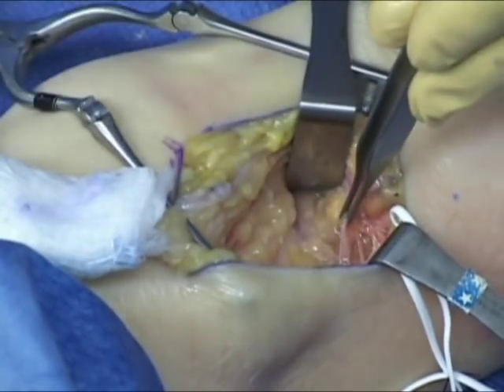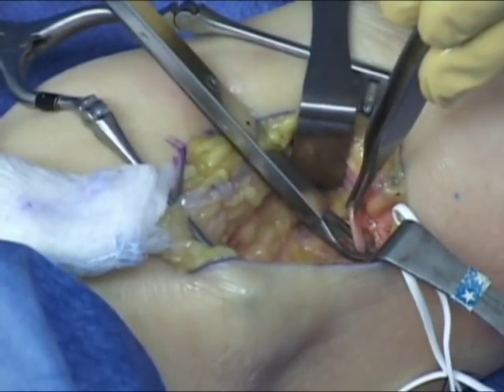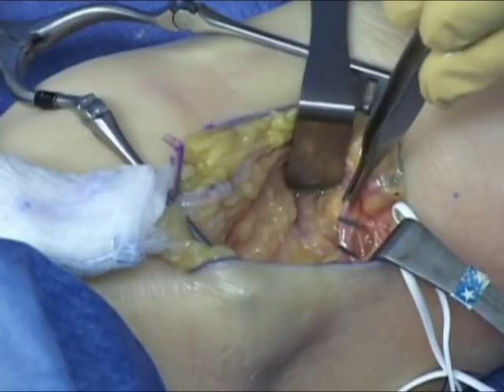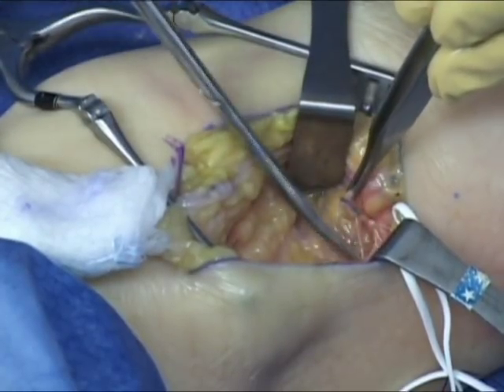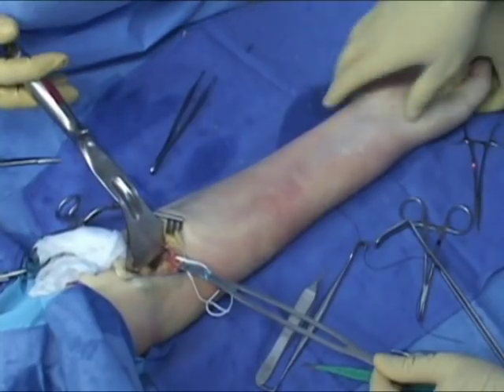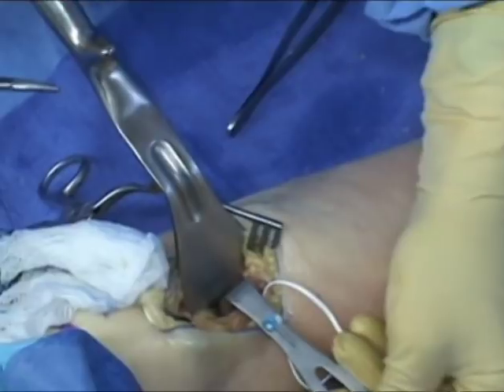The radial soft tissues are gently retracted, taking care to avoid excessive traction on the radial nerve. Henry's recurrent vessels are identified. It is helpful to use medium hemoclips to ligate these vessels. With supination and pronation, the biceps tuberosity is again identified in preparation for drilling.